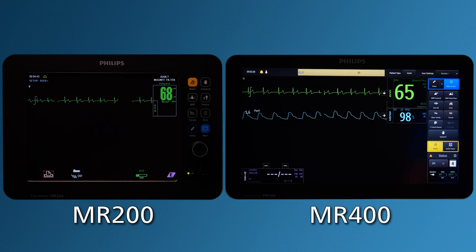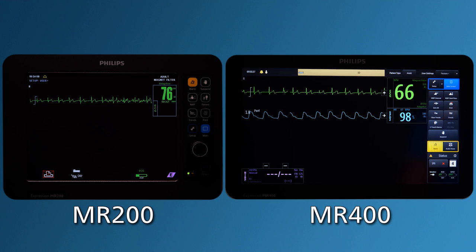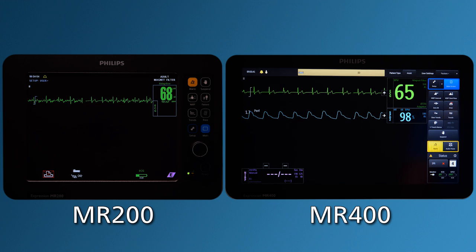The gating feature on the Expression MR400 and the Expression MR200 outputs data and discrete signals to the MR scanner system, allowing the scanner system to use those signals and data to precisely control the times that it collects MR image data from the patient.